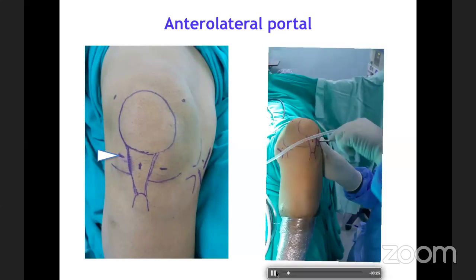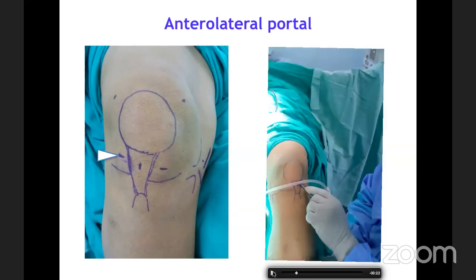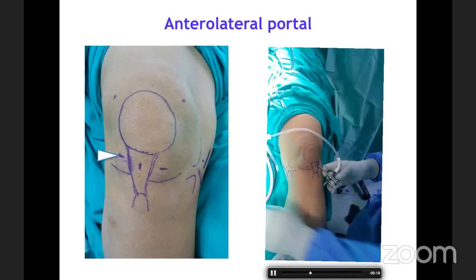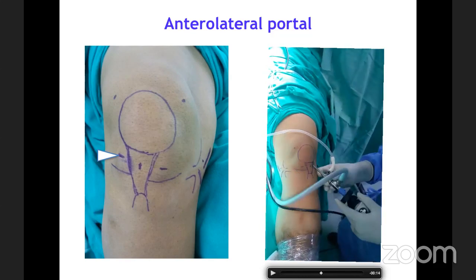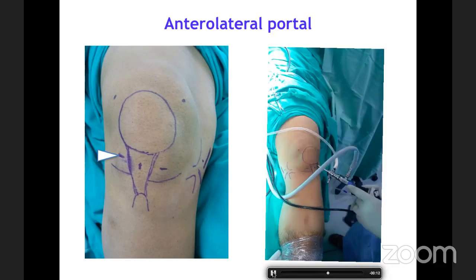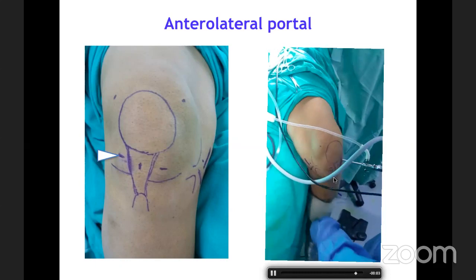The anterolateral portal is made at 90 degrees of knee flexion. You insert your trocar to the trochlear notch, and once it is in, you start extending the knee. At 30 degrees of flexion, you start passing your trocar cannula into the suprapatellar part, and after full extension you remove the trocar, then pass the cannula, scope, and camera. The water inflow is very important — many times early on you pass the scope and see nothing because water is not flowing. After checking the inflow, you slide your scope toward the medial side and start flexing the knee to enter the medial compartment.